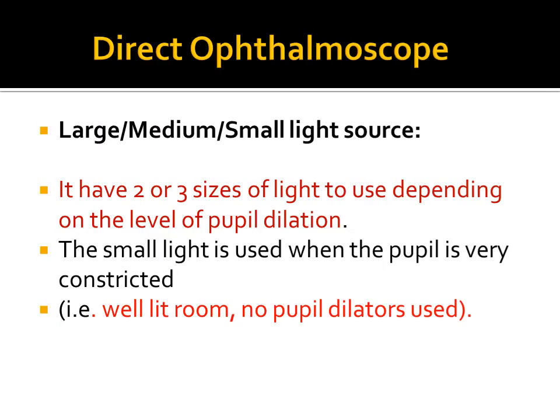Now, the large, medium, or small light source. Which size we will use depends upon the dilatation of the pupil. Otherwise, it may create difficulty while examining the patients.